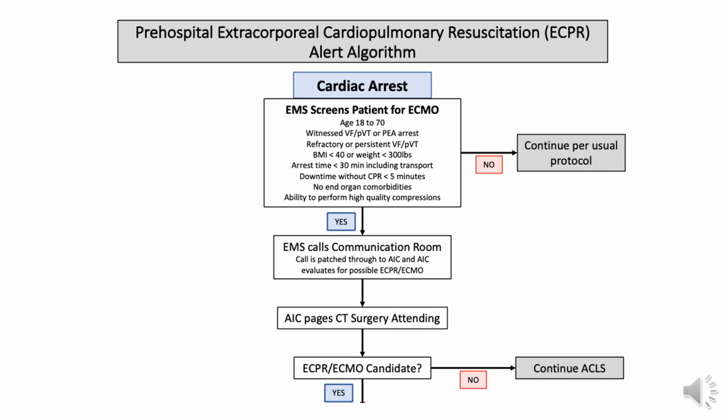We're going to continue ACLS, okay? And we'll continue to work the code just like we would normally. But I hope you guys understand, because of all the other exclusion criteria, logistics, availability, there will be people that come in that you think are great candidates that are not going to get cannulated. And that can't be the expectation that 100% of those folks get cannulated. In all of those studies, people made it to the ED and didn't go on pump for one reason or another. So please be accepting that that's the fact. And we know that you guys are going to try your hardest and work your hardest, and we'll appreciate the sweat, blood, and tears that you guys put into these patients, but understand that not all of them will go on pump regardless of which hospital you go to.